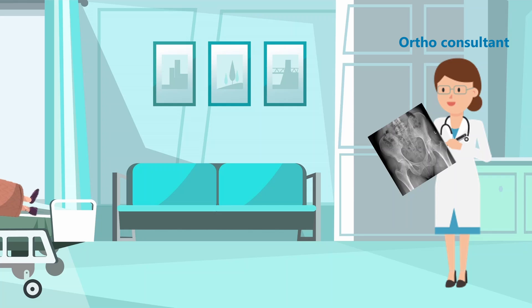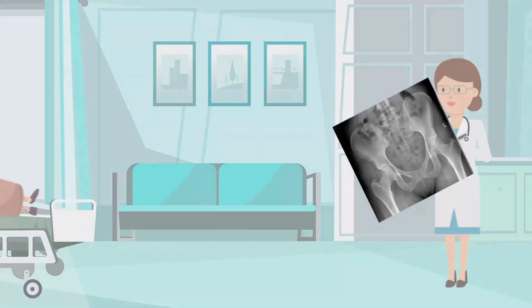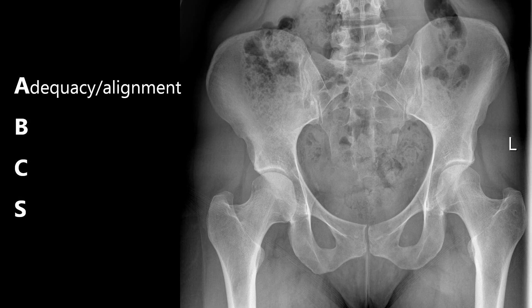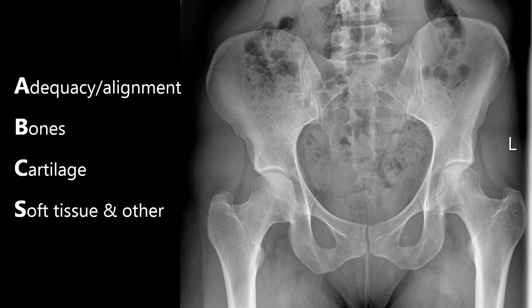The structure we use to interpret hip x-rays is ABCs. This stands for adequacy and alignment, bones, cartilage and soft tissues and other.